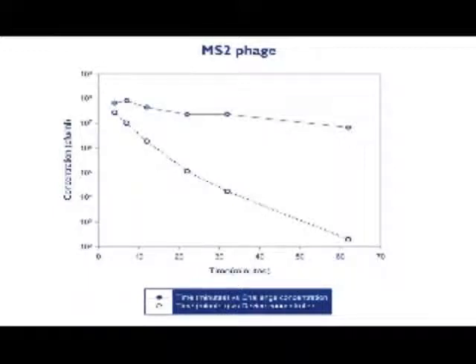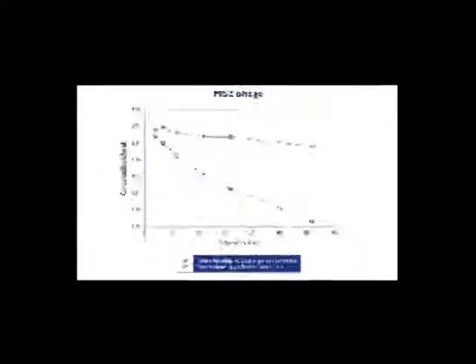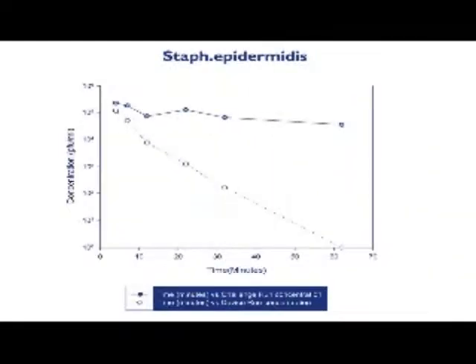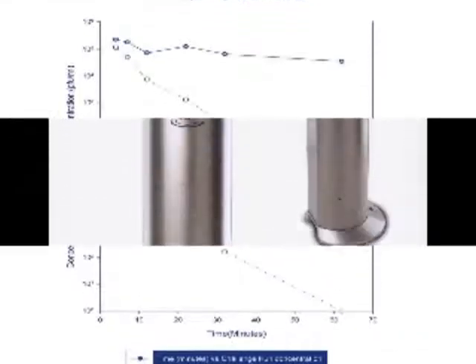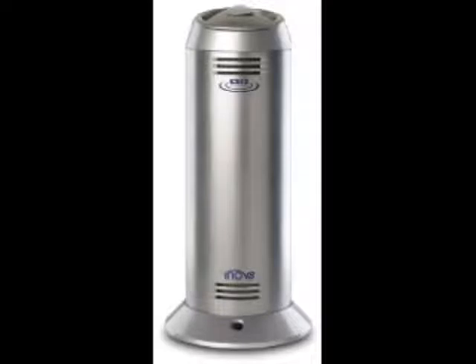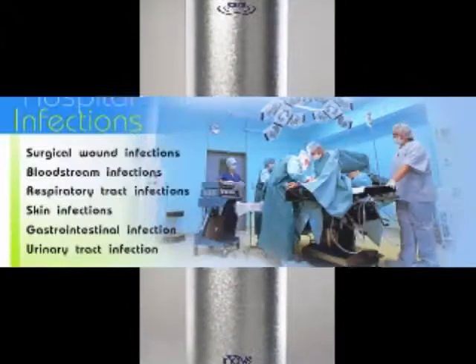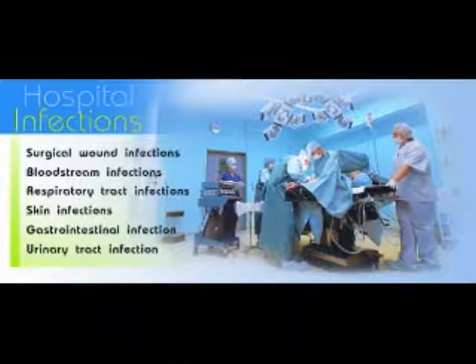And what about this car wash style bed cleaner that's also in the news today? Well, one of the problems we have is that with lots of equipment for patient transport and beds included, they're quite intricate and they're very difficult to clean manually. If you ever look at a bed, a particularly modern bed with lots of levers and cams and quite a complex frame, using hand cleaning is difficult and difficult to see how you can get into all the crevices.